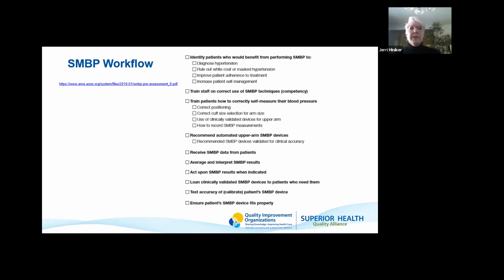That's something that they need to do. What you're going to do if you receive SMBP data from patients. Also, a number of the things that we've already talked about, looking at the accuracy and then ensuring your patient's devices fit properly. So things that we've actually covered through a number of our sessions that we've already had, but this is just kind of a nice little checklist all in one place that you can use.